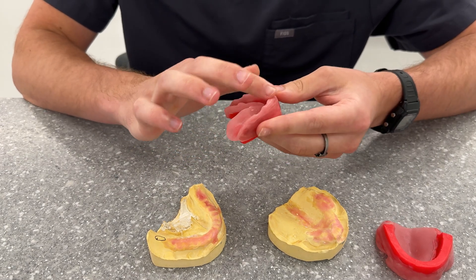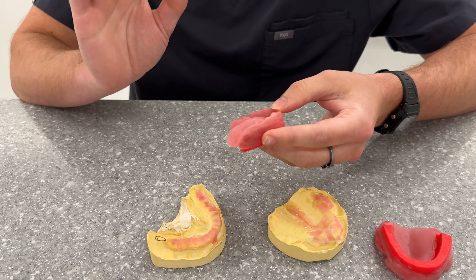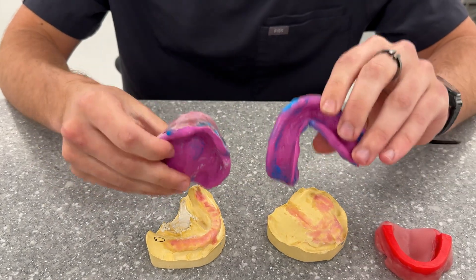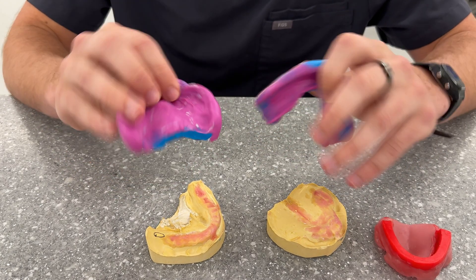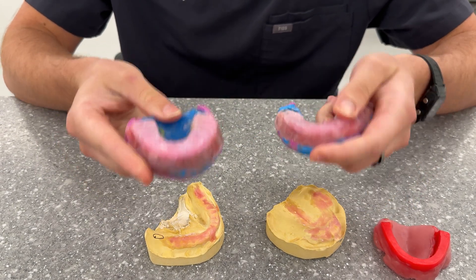When you go into your appointment you're going to do your border molding first with your heavy body, and then you're going to be taking your final impression and it's going to look something like this. It's really large and really bulky, but it captures all of the areas that we really need to for these digital dentures. We'll capture our intaglio surface, we border molded, and then we'll immediately just do our maxillomandibular relations on it.